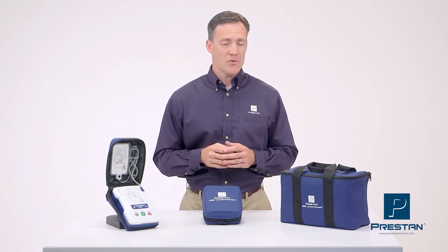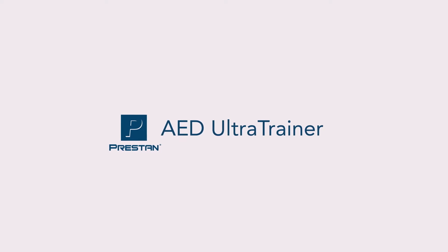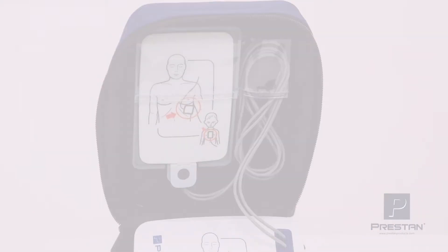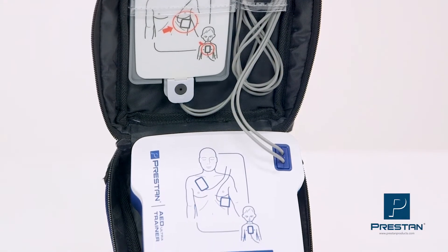Now you can upgrade to a better option. Introducing the Preston AED Ultra Trainer — a reliable, state-of-the-art, quality product that is not only affordable.